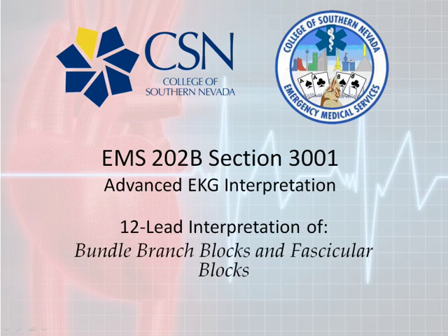This presentation is for the College of Southern Nevada EMS Paramedic Program. Today we're going to talk about bundle branch and fascicular blocks in 12-lead interpretation.